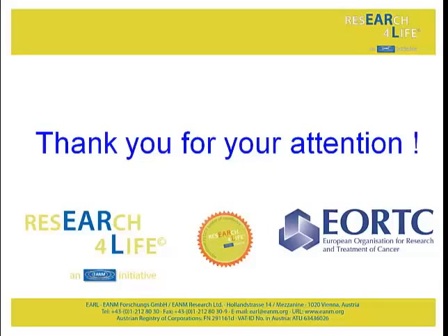So what we do between the people that are doing clinical trials and the vendors is that there is a third party that states, using quality control, calibration accuracy and image quality, that in this center you are performing PET scans to a certain standard. So it says whether you may use your center, a Kuwaiti center or an American center or an Arabian center or an Italian center, in a study. Yes, you can do a study all together because they are all performing PET/CT with the same image quality, and there is a third party stating that. But also they meet their standards, so they do the calibration, they do their homework, everything. That is all part of the quality standards.